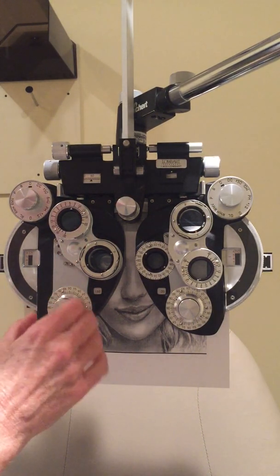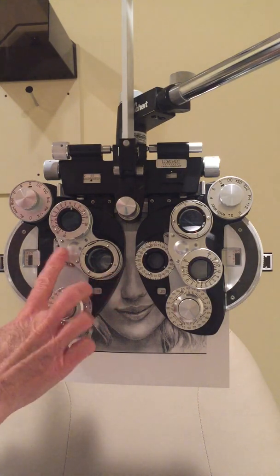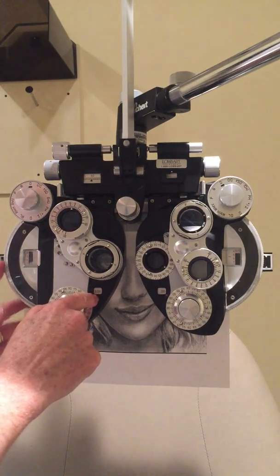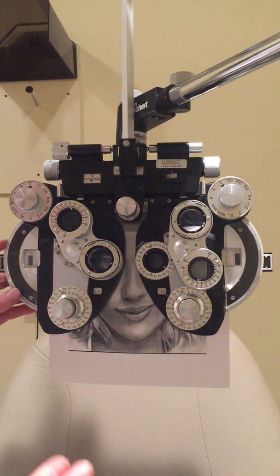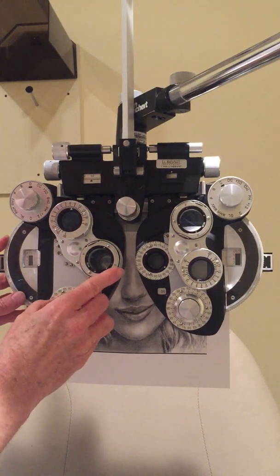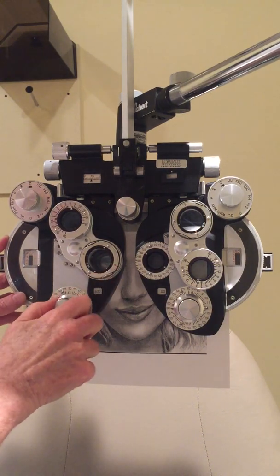When she can't decide between positions, that's the end point for axis. I flip over to check power. She prefers more cylinder — two clicks of cylinder — which means I need to perform the spherical equivalent. Since this is a plus-cylinder phoropter, I add a quarter diopter of minus sphere to balance and keep the circle of least confusion on her retina. I then ask again and she still wants a bit more cylinder.